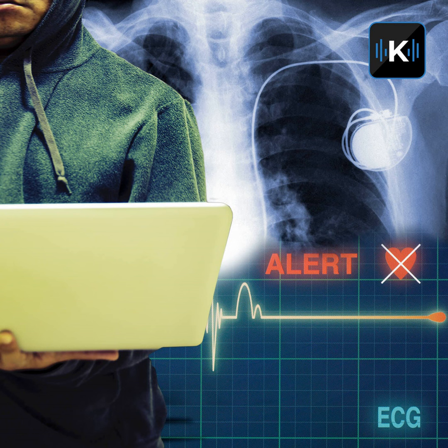When we look at exploiting medical devices, we kind of look at two different things. One is what's called intended functionality, and basically that just means making the device do something it was kind of designed to do already. Like, for example, a pacemaker is designed to deliver a shock, right? It's actually designed to do that. And so if someone can take over the communications path to a pacemaker, they might be able to initiate a shock at a time that it's not supposed to be initiated, right?